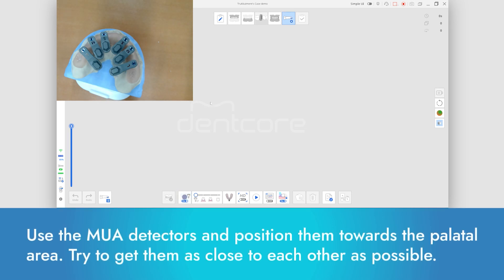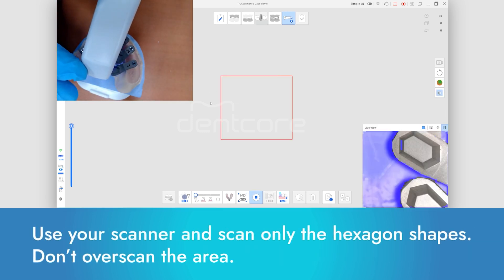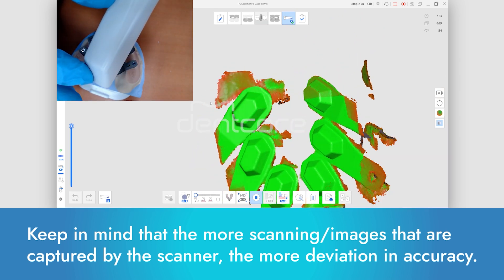Use the MUA detectors and position them towards the palatal area. Try to get them as close to each other as possible. Use your scanner and scan only the hexagon shapes. Don't over-scan the area. Keep in mind that the more images captured by the scanner, the more deviation in accuracy.